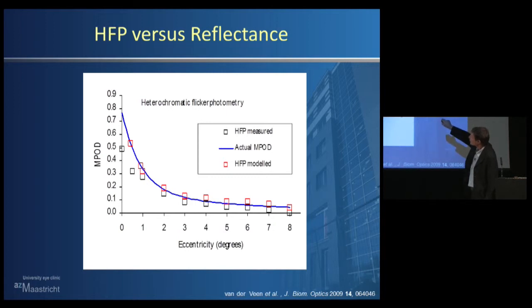And then at the very center, you also come up with a problem. That is because if you do psychophysical measurements, you most probably null your flicker, or press the button when you see something flicker, not in the very center, but somewhere around the edge. So when you say it's a 0 degree measurement, depending on the width of your measuring, you're actually measuring at 0.7 degrees. So if you put in both, you can actually put the two on top of each other.